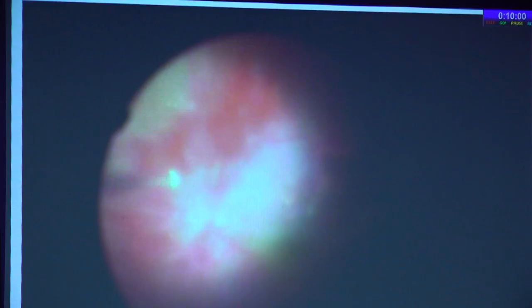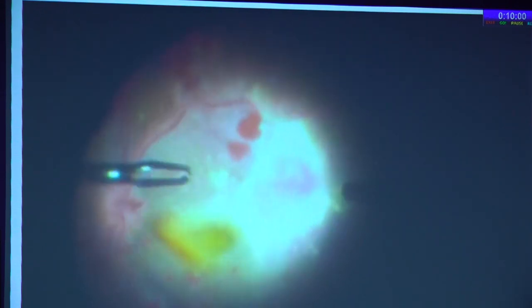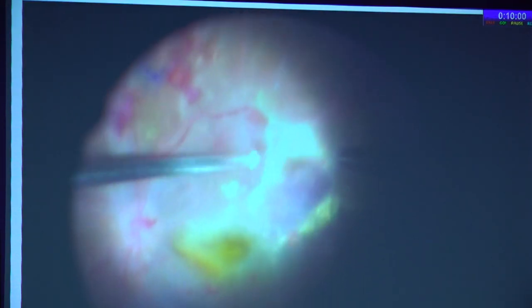The problem with the diathermy is sometimes the clots may stick to the probe, so you should allow ample time for the cooling with the infusion, so that the probe separates from the clot on its own, and do not try to pull it off the clot.